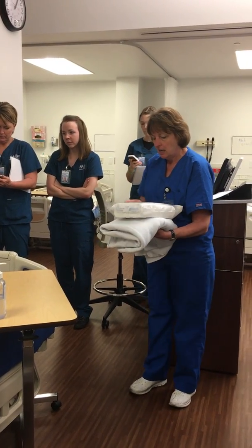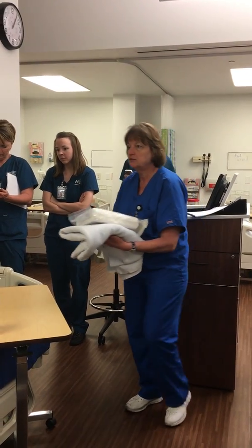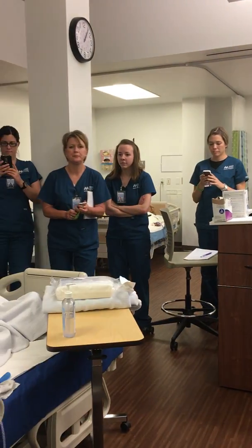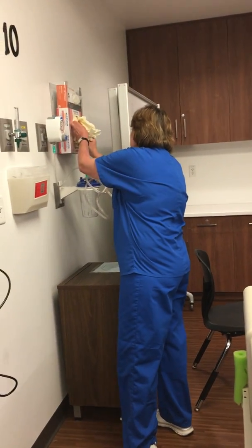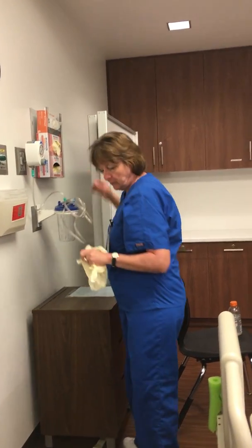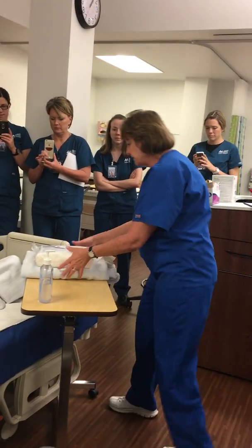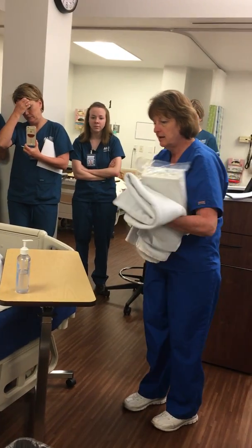I need an extra bath blanket, and I need my wipe, and I'm going to grab some gloves so I'm not reaching over here the whole time. I got hand wash in the room, so I'm good. So I've got all my supplies, so come on in and I'll knock knock.